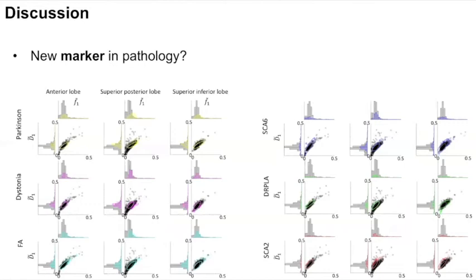And we scanned patients with different movement disorders in collaboration with clinicians, where they had a very specific question: whether the cells are actually affected in the cerebellum, or is it just atrophy and the cell packing and the cell properties remain the same.